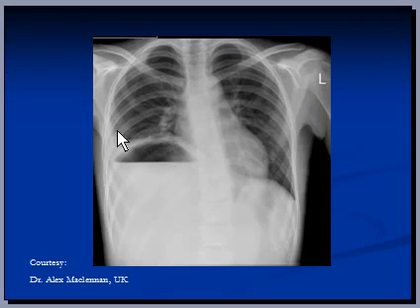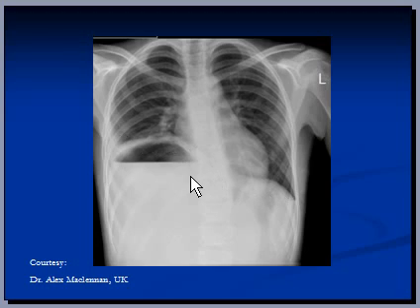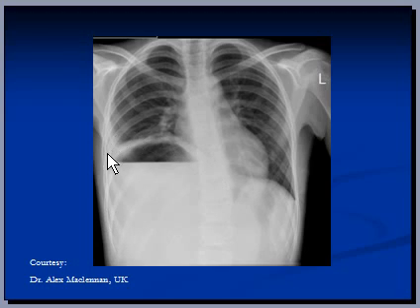Number one: the right hemidiaphragm is significantly raised. This is the left hemidiaphragm, and the right hemidiaphragm should be somewhere here. It is significantly raised in this patient.